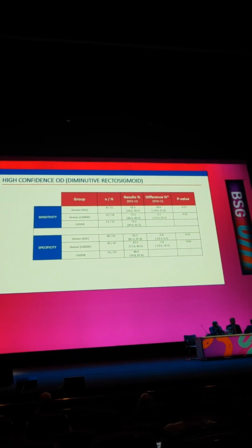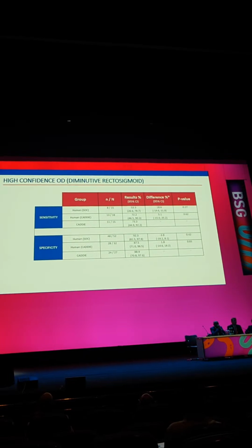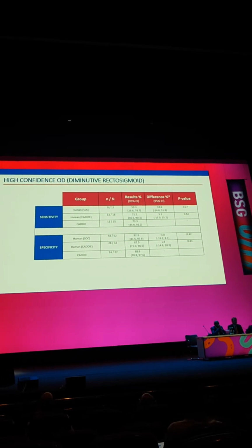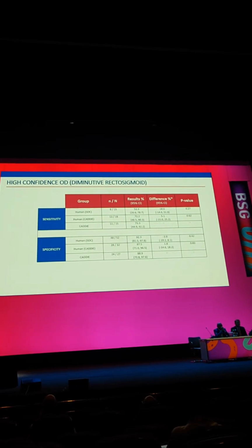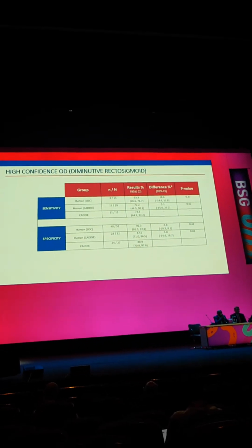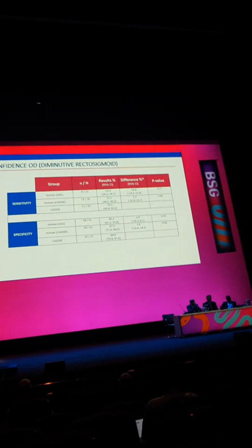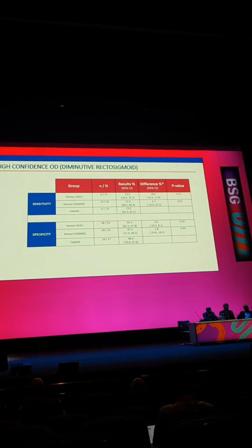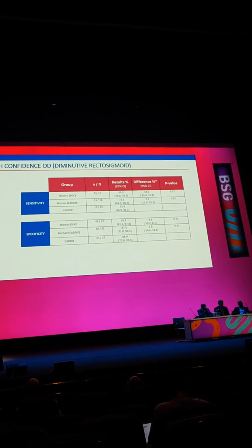Given that this paradigm is in essence adenoma versus non-adenoma, or adenoma versus hyperplastic if you like, that's basically as good as flipping a coin. So it's pretty alarming, and most of these endoscopists do perform diagnose and leave in their practice. You see the performance of CADx here is about 73%, and quite reassuring when you see that when humans were given the CADx system, it did bump up towards the performance of the autonomous AI system.